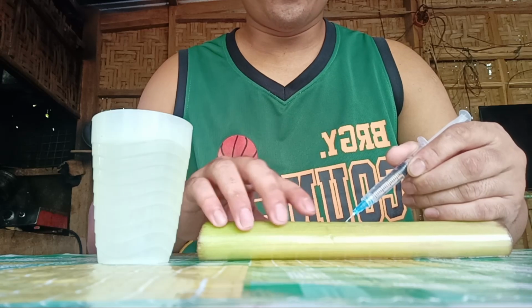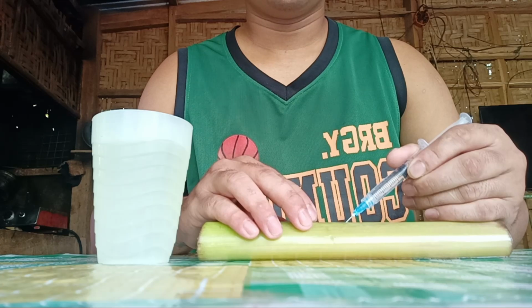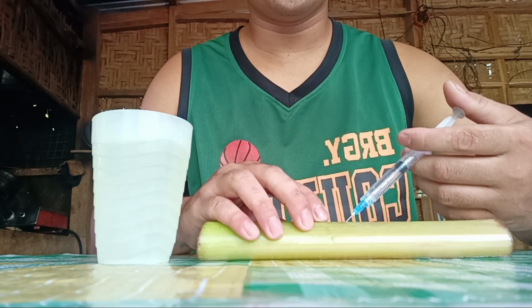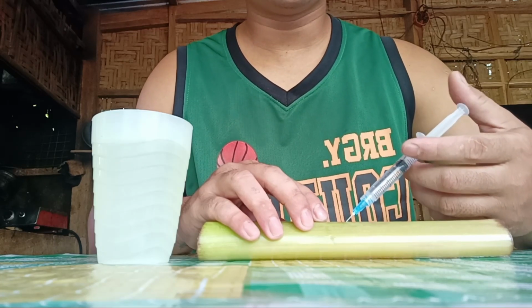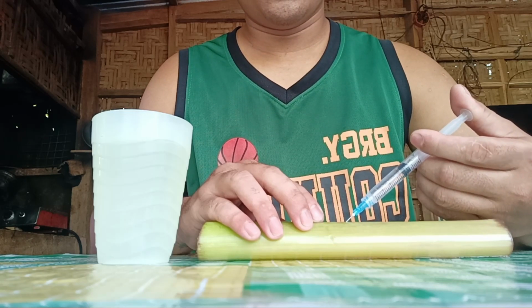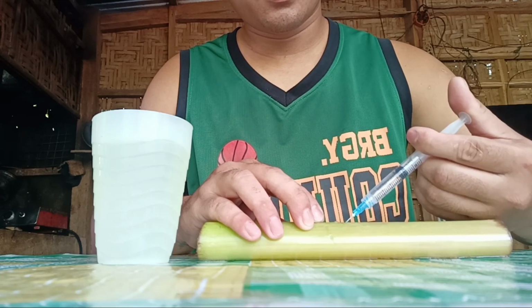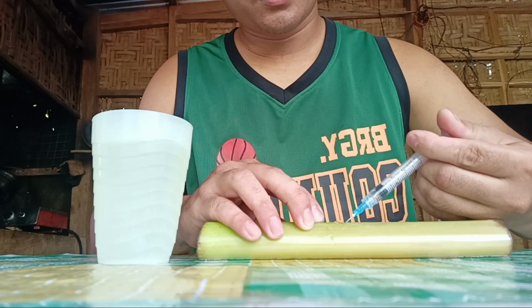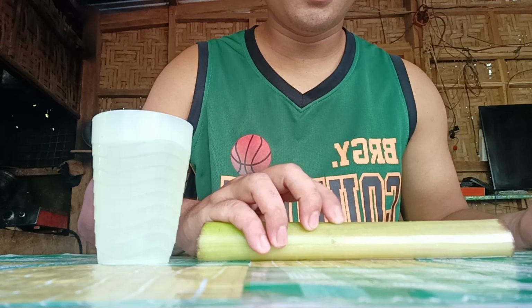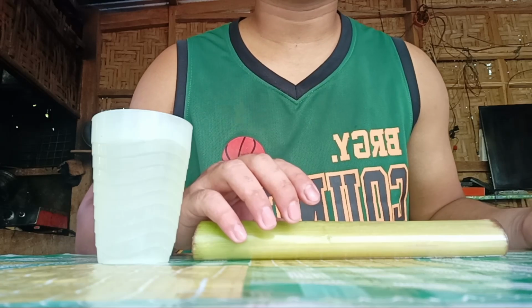Make sure not to fully insert the syringe, because we only need to reach the subcutaneous tissue, because that is the target of injecting subcutaneous. Now inject the medicine. Massage after injecting. And that is the proper way of injecting subcutaneous.